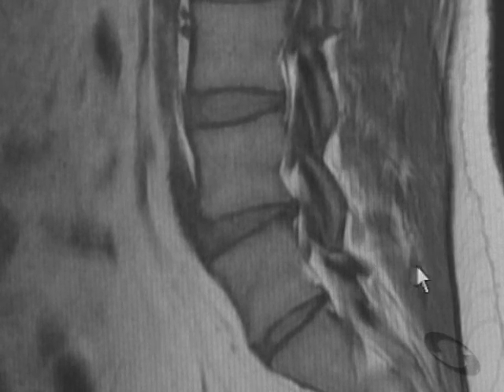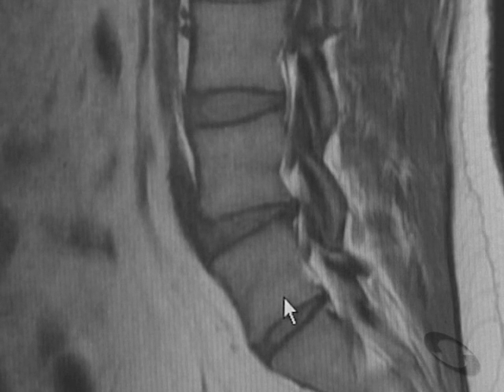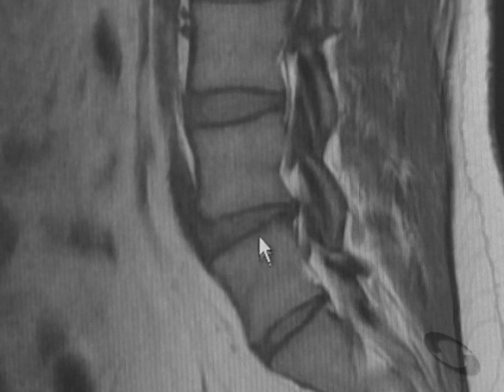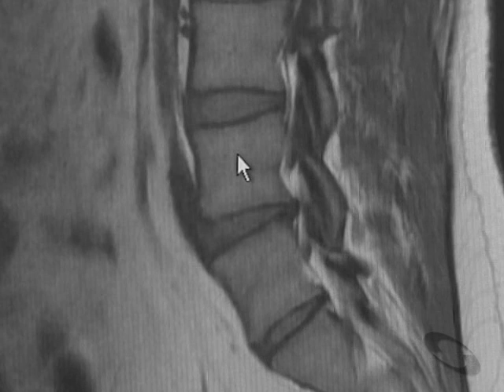Okay, I'd like to go through this patient's preoperative MRI scan. Basically, he has a lumbarized S1, and this is what I'm calling S1. This would be S2. This would be L5. And this is what we would call a sagittal section.